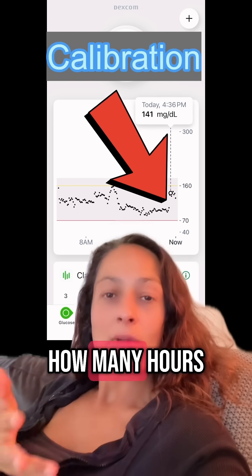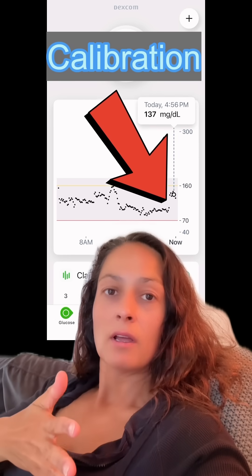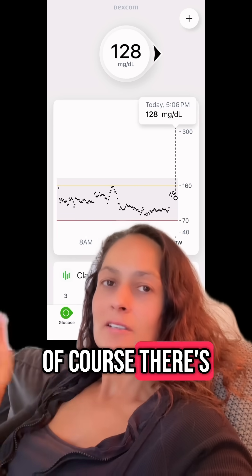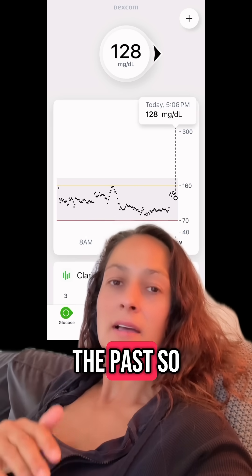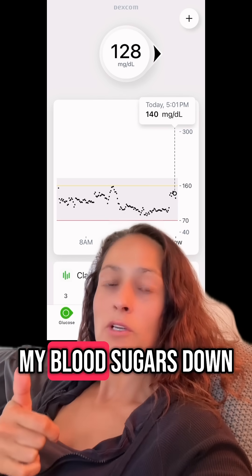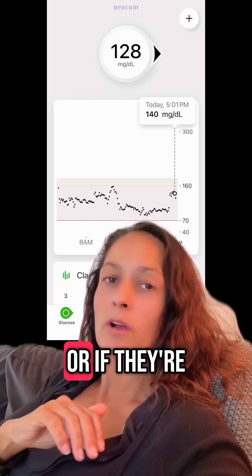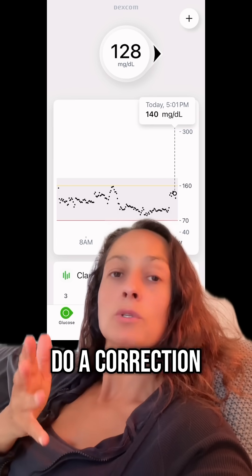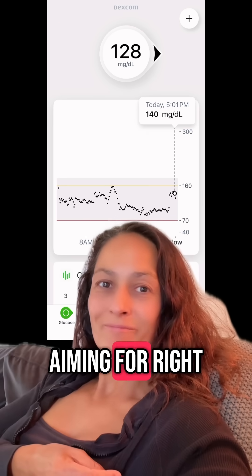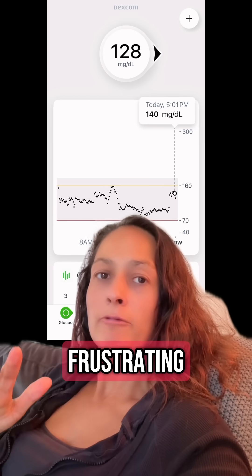It also made me think: how many hours had I been closer to 160 than to 100? The frustration is real, but of course there's nothing I can do about it now — this is in the past. So now I do a correction to get my blood sugars down. I usually correct if they're around 140, or if they're coasting at 130 I might also do a correction. This is not the blood sugar I'm aiming for — I'm aiming for closer to 100.